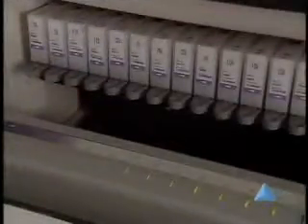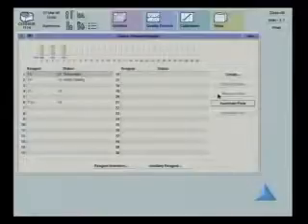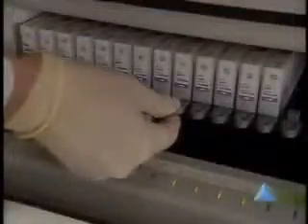To remove a ready pack when the LED is green and the system is in process, follow these steps. At the workspace, select the Reagent Status button. Select the Primary Reagent button if this window is not already open. Select the reagent and then Remove Pack. If prompted, select Complete or select Now. By selecting Complete, the tests scheduled for that pack will be completed before the pack is removed. By selecting Now, the pack will be removed without completing the tests. When the status changes to removable and the LED changes to neutral, remove the pack.